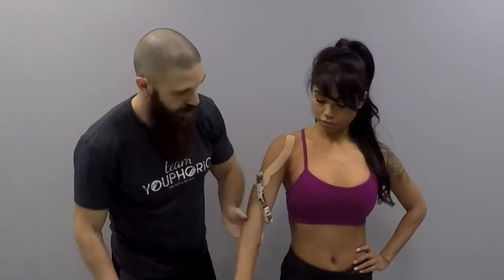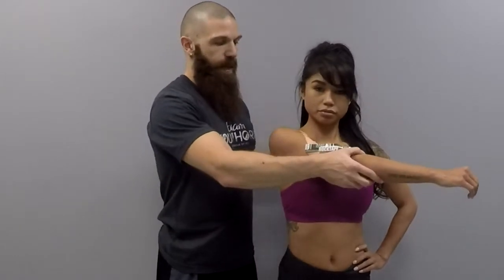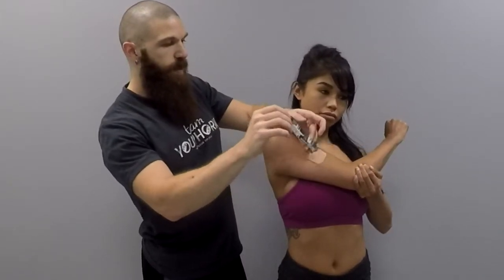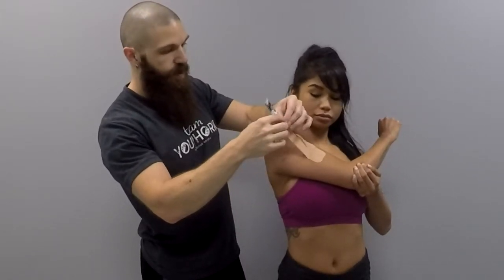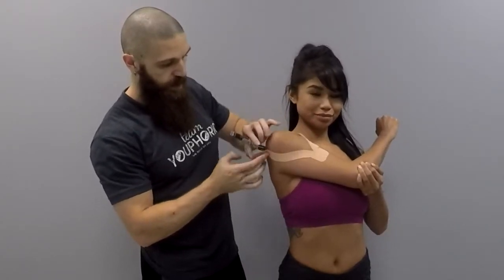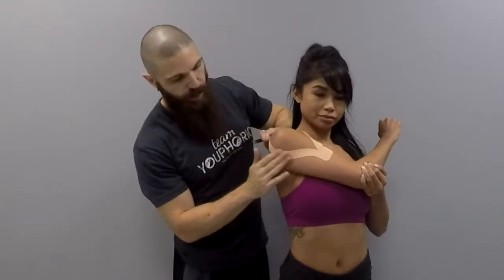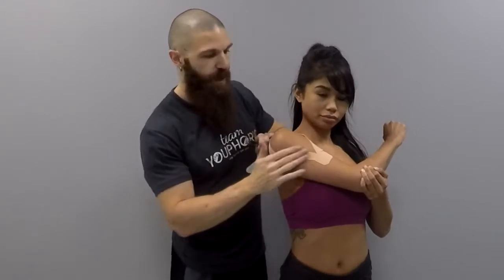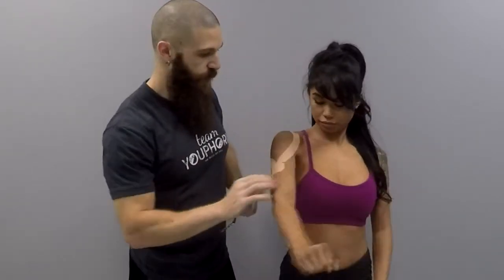Then we will take them into flexion and adduction — get them to hold their arm towards their chest as much as possible. You are going to trace the posterior deltoid with very little tension, activating the adhesive and making sure that the end has no tension in it at all. Then have the client relax their arm.